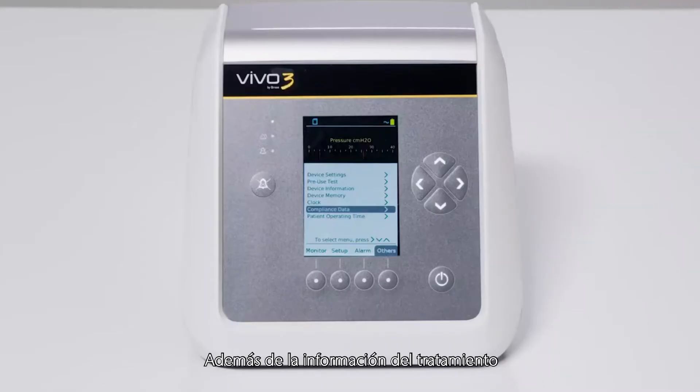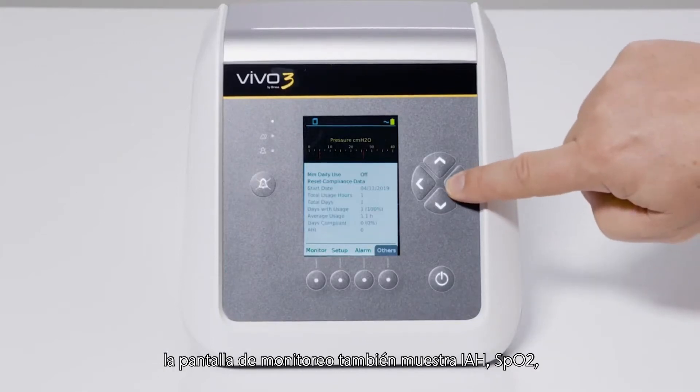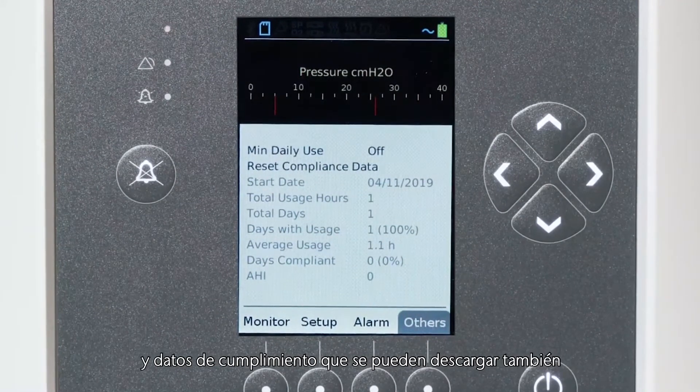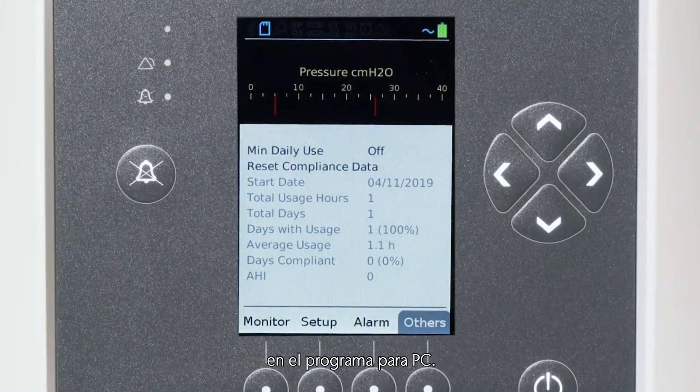In addition to the therapy information, the monitoring screen also displays AHI, SpO2 and compliance data, which can also be downloaded into the PC software.